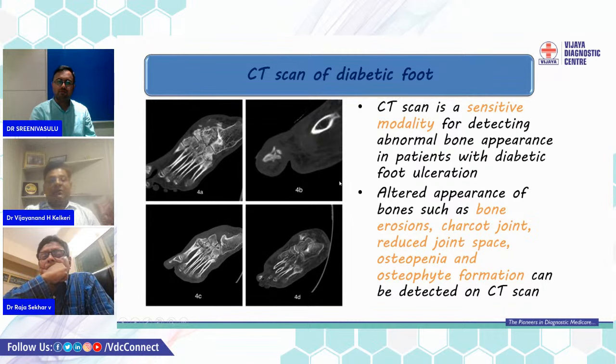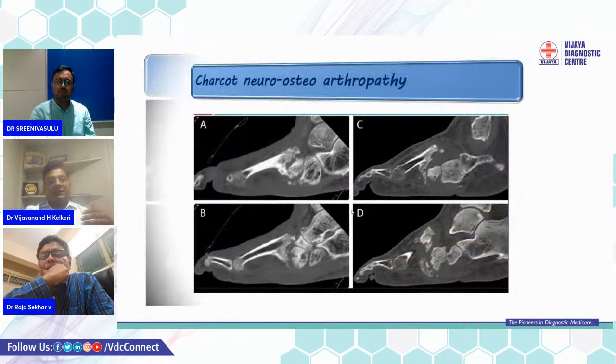Okay, so the clarity is slightly more in the case of CT scan because of the three-dimensional or multi-parametric approach. However, X-rays also give maximum information to experienced eyes.